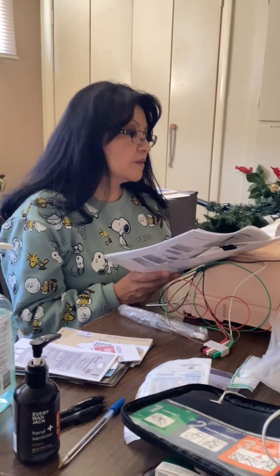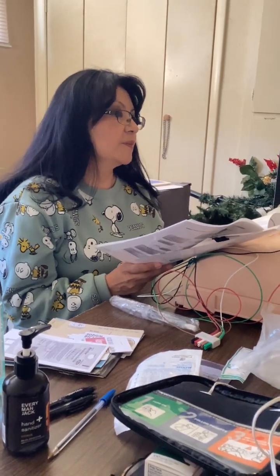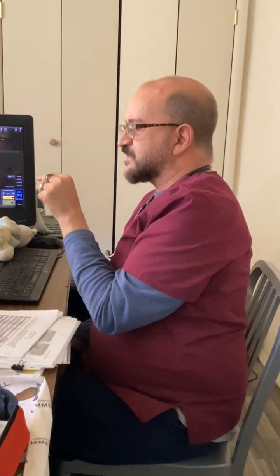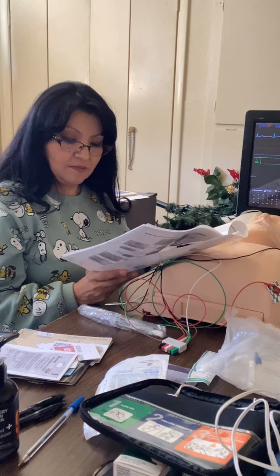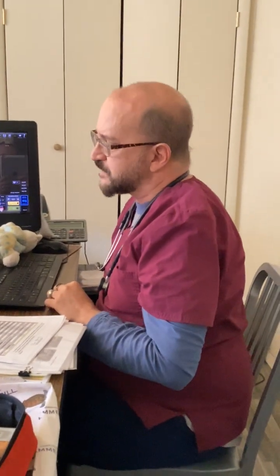Effective compression. What if you saw the number at 5? To increase the rate of compressions. Yeah, and the depth perhaps, so they're not effective. Right. What if you're compressing at 10 and suddenly you see a sudden rise by another waveform? You've hit ROSC. So check for pulse quality, which is usually going to be weak. You're going to need to do fluid boluses.